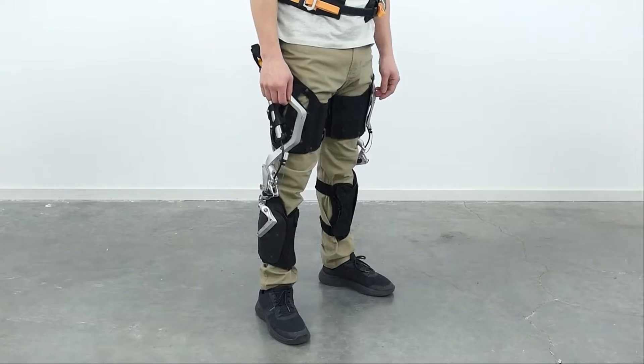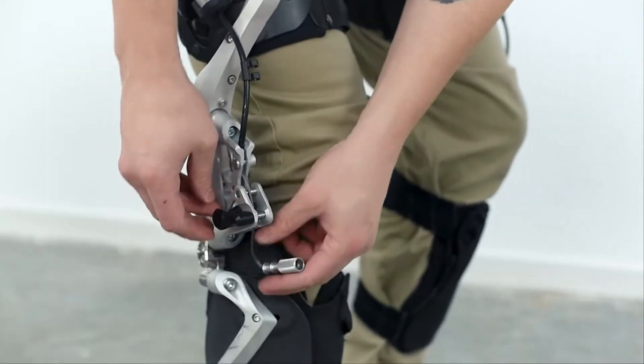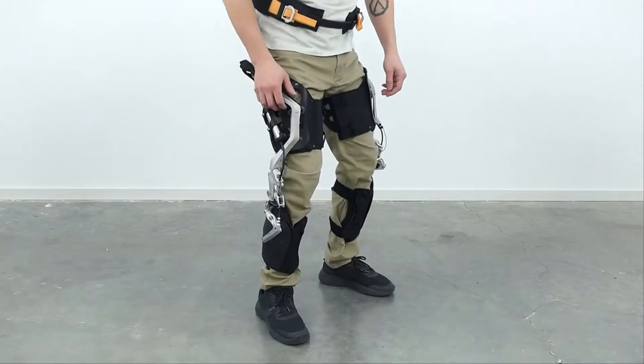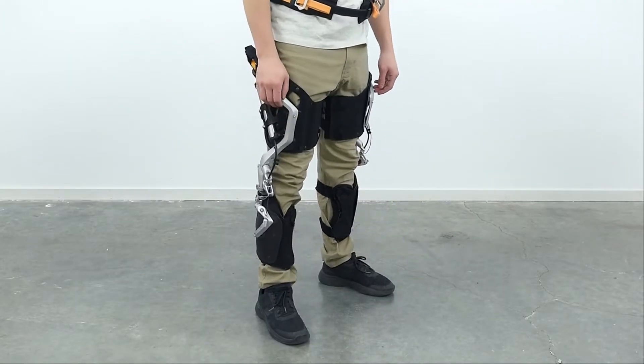To engage the leg assistance, unclip the knee cable end from its retainer and, while pulling on the spring-loaded knob, insert the cable in the mechanism. Upon releasing, the system will now be active at its highest level of support and earliest activation angle.